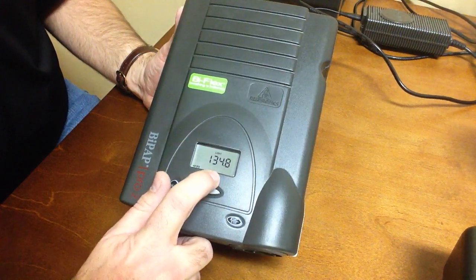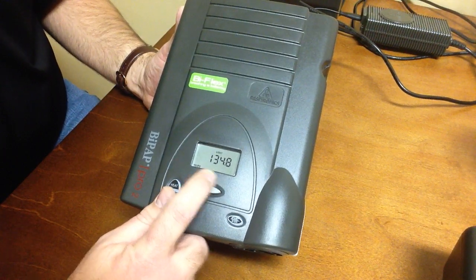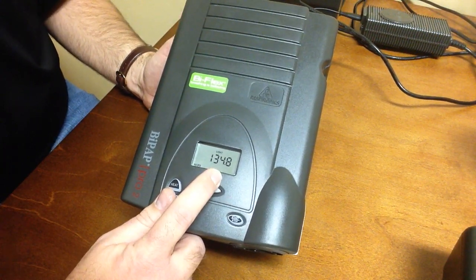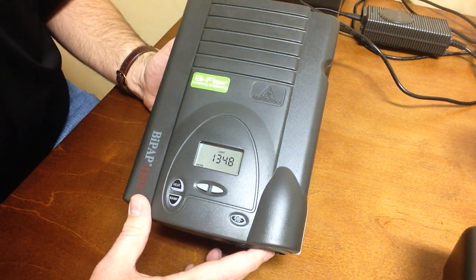The other thing you want to watch for is the decimal point. Here you have 134.8 hours. Always take note of that decimal point, and again, it's always the highest number displayed at startup that is the total machine hours.